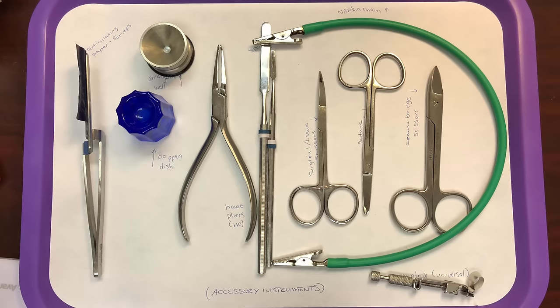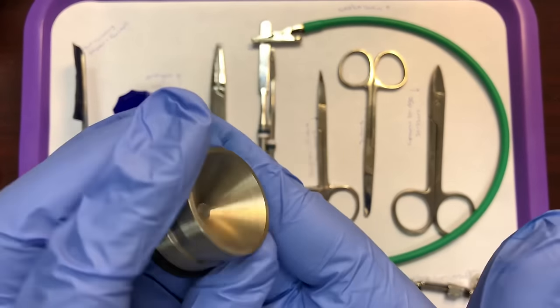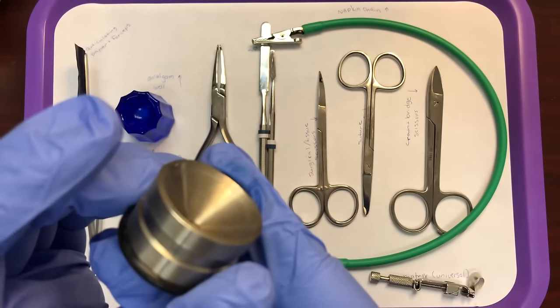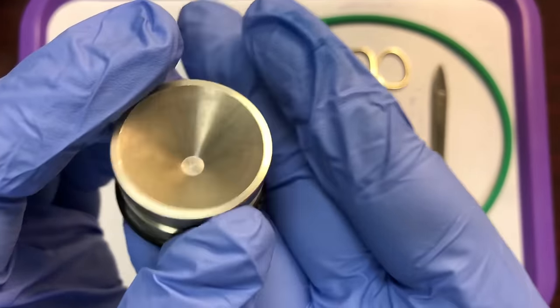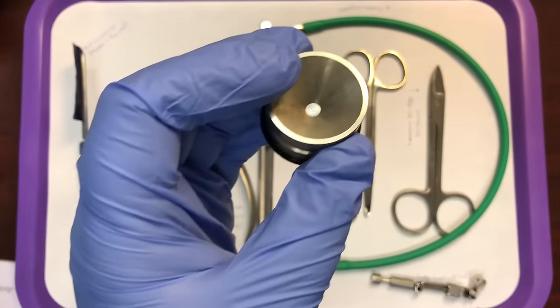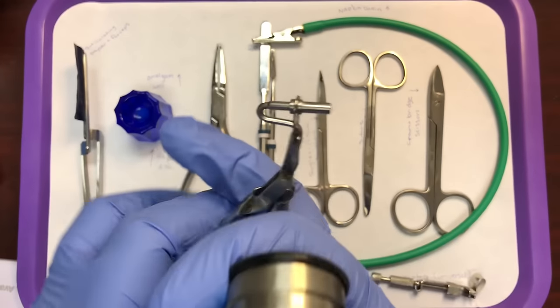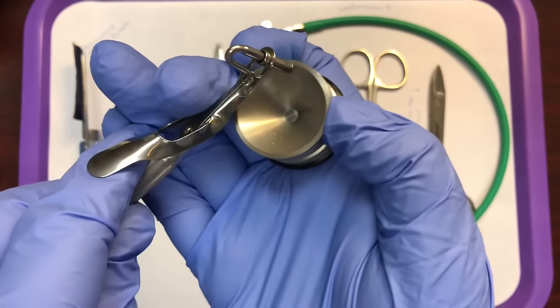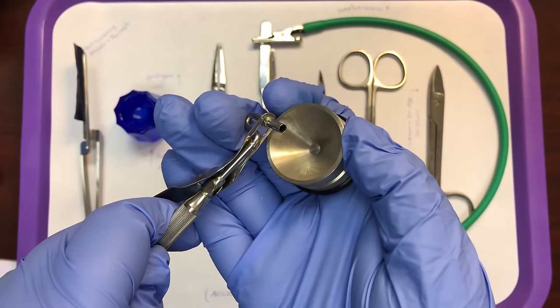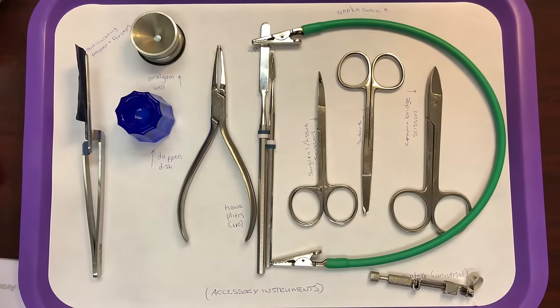Next we have an amalgam well — this silver bowl. Your amalgam well is used to hold amalgam after it's been mixed. We place the amalgam in the well and then take our carrier to scoop it up and press until the carrier is filled. Your amalgam well simply holds your mixed amalgam.